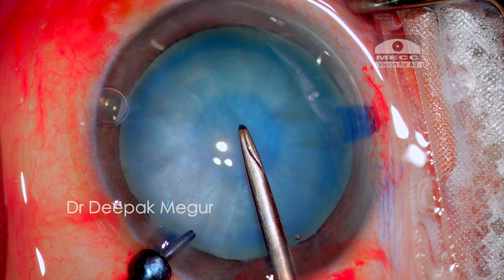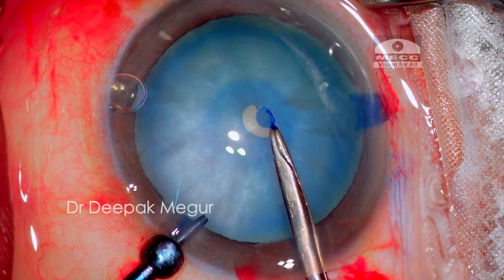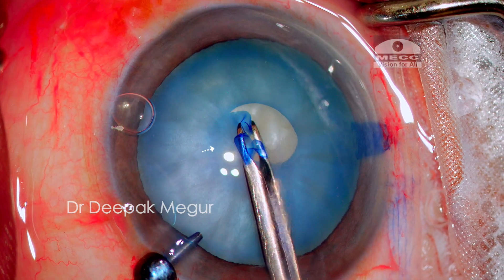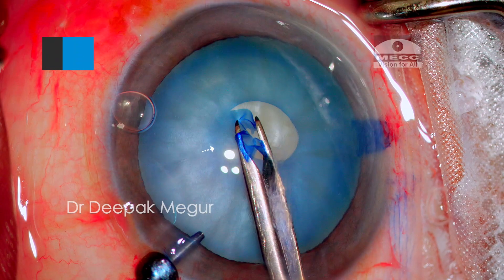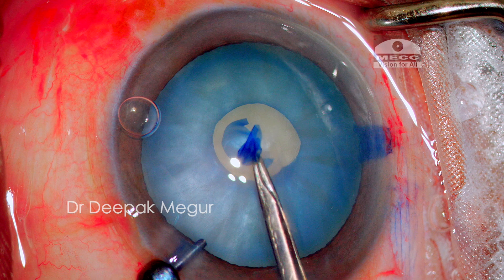Anterior chamber depth is maintained, which is the most critical factor. Even during primary rhexis creation, the capsule has the potential to run peripheral, so I make certain modifications. As I puncture the capsule, I don't make any attempt to lift, evert, or fold the flap as I would in regular cases. I keep the flap flat, not everted, and tear it in a centripetal manner in short spans. We can see it still has a great tendency to be uncontrolled and run away. Eventually, the primary mini-rhexis is completed and I have a small 2–3mm rhexis.